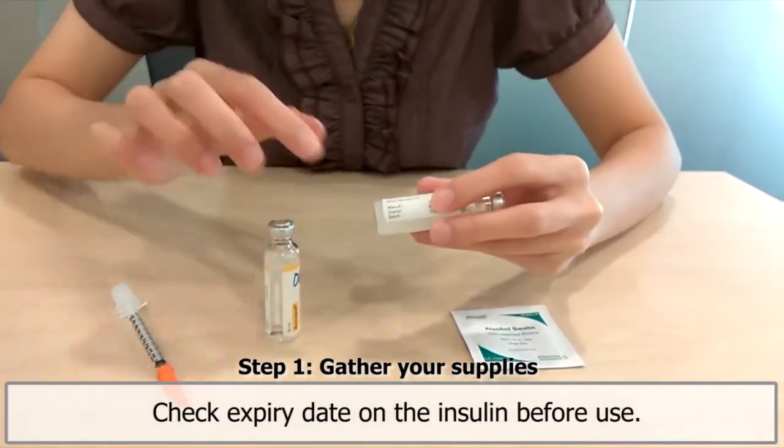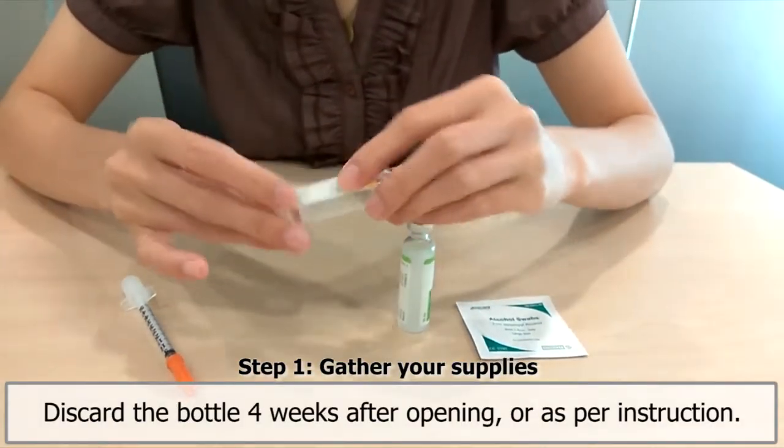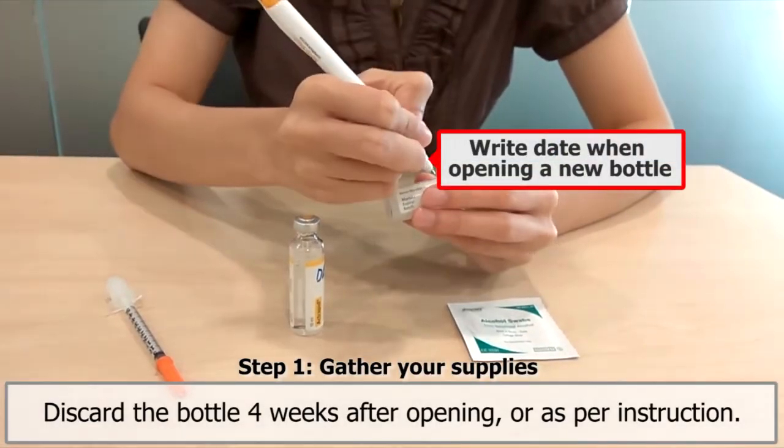Check the expiry date on the insulin before use. Discard the bottle four weeks after opening, or as per instruction. Write the date when opening a new bottle.